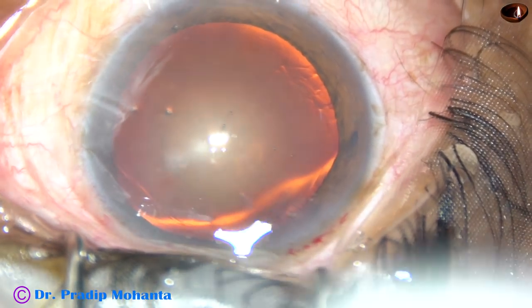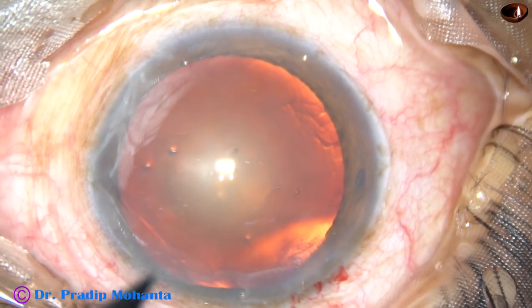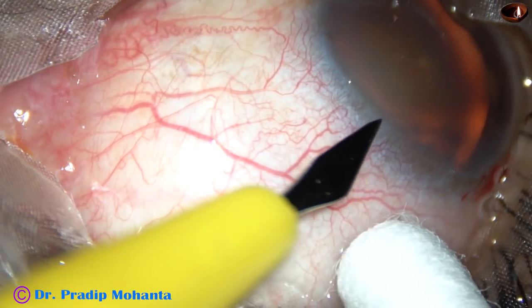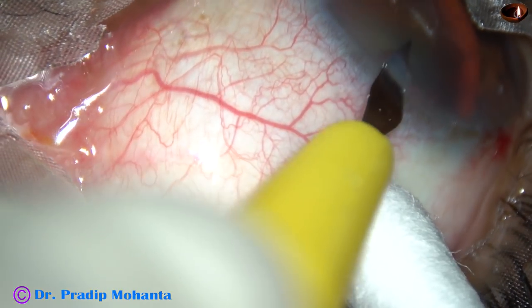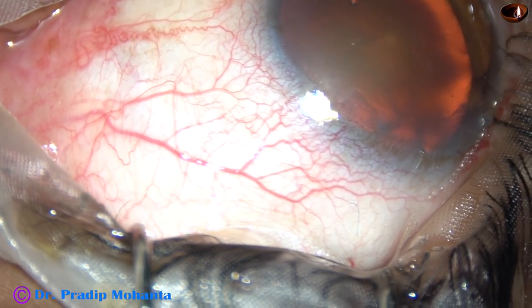In this case, I am going to make only one side port — only one side port about two clock hours away from the main incision. The side port is made.